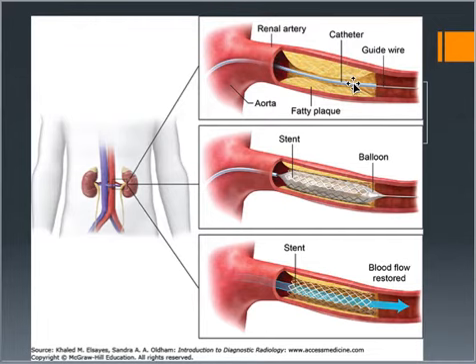And then what they do is they'll put a stent right over that guide wire. They're going to follow that all the way down, push the stent a little bit further past the area of the plaque. Then they're going to inflate a balloon that's inside of that stent. The balloon blows up and pushes that stent up against the walls and kind of smushes that plaque down and opens up that artery.